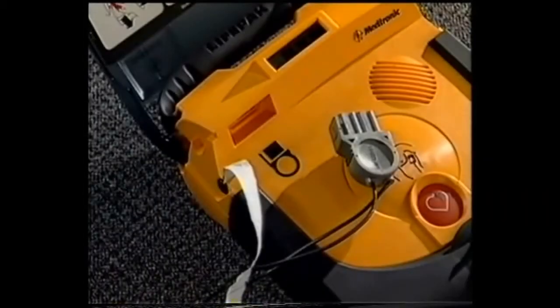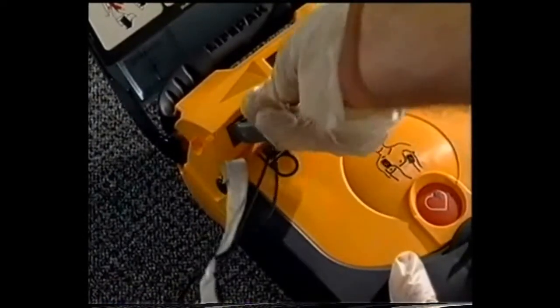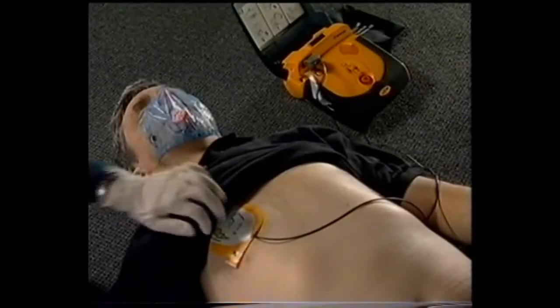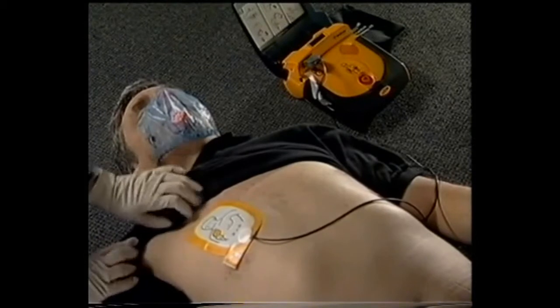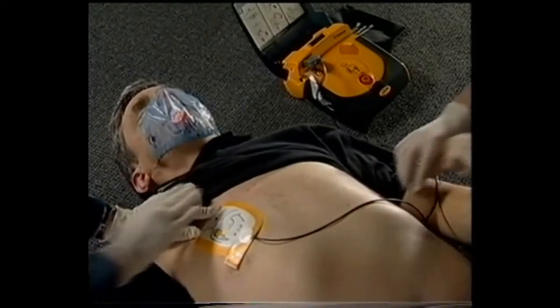If the pads detach from the patient or from the defibrillator, it will say, "Check pads for good contact." You should check that the connector is completely inserted. Check that the electrode pads are on the patient's skin and not the clothing. Firmly press the electrode pads on the patient's skin.